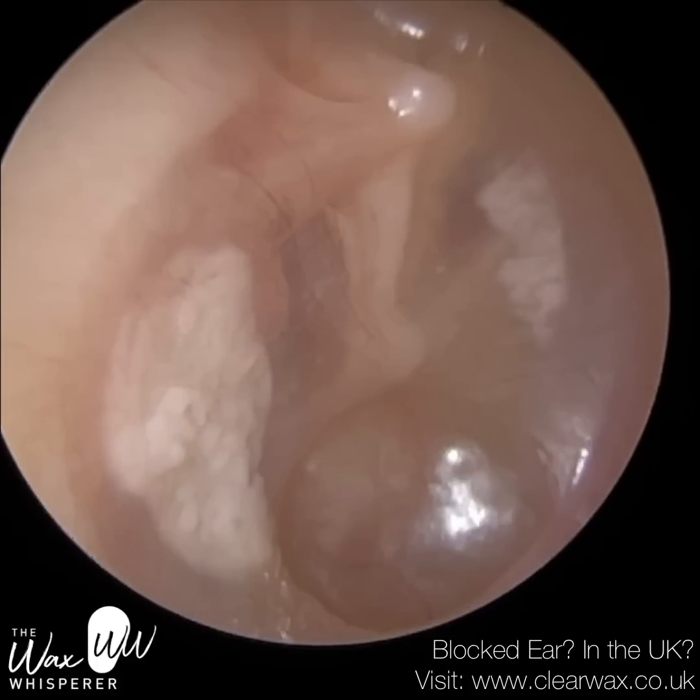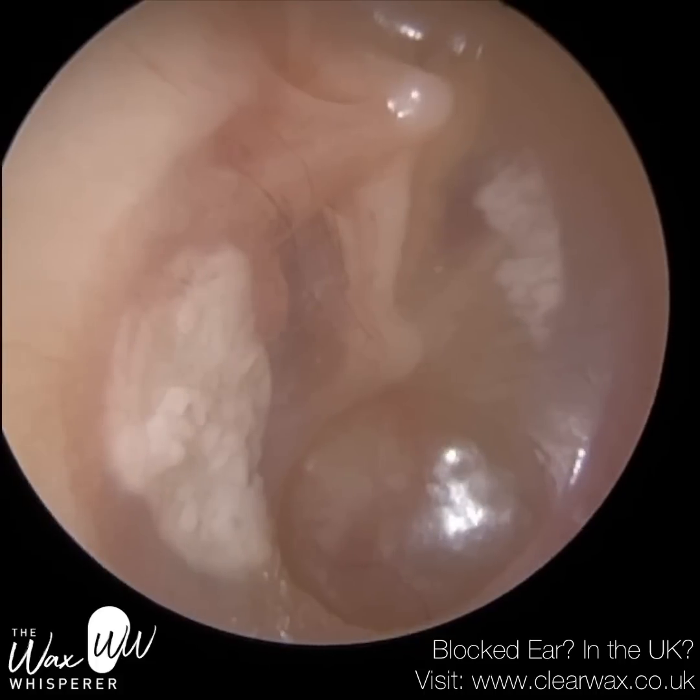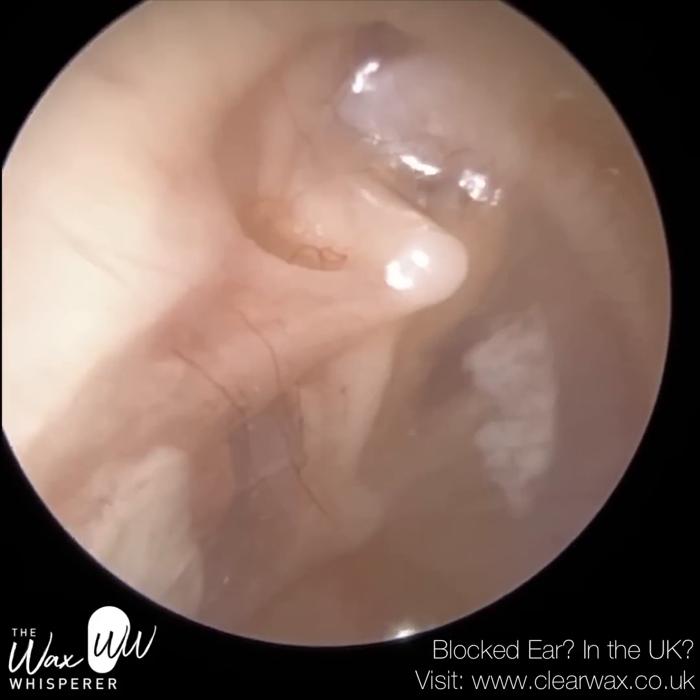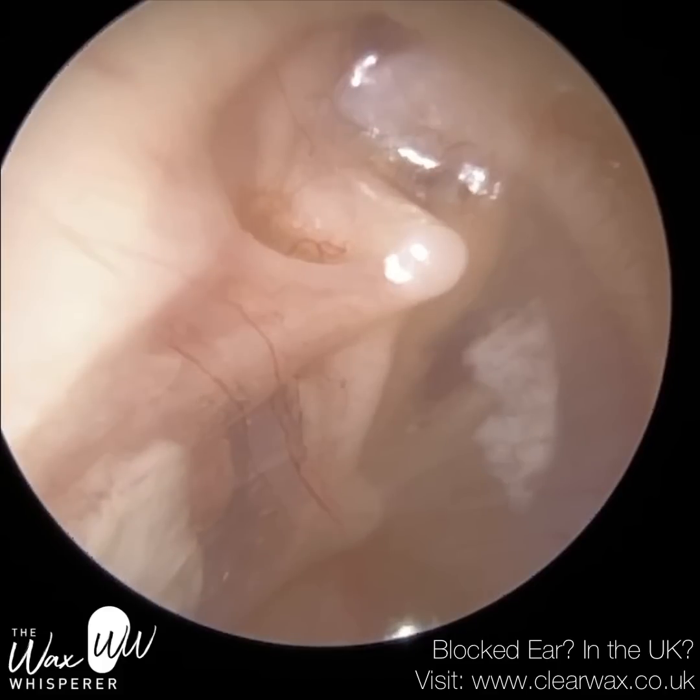So this is their right eardrum. You can see at 6 o'clock the eardrum is sucked in, and also at the attic — at the top — it's sucked in. At 3 and 9 o'clock they've got scar tissue, tympanosclerosis, so they have had a previous grommet, as their parents advised me.